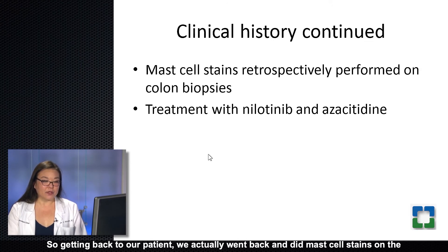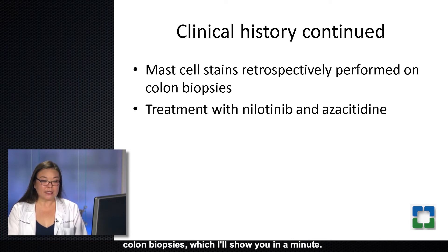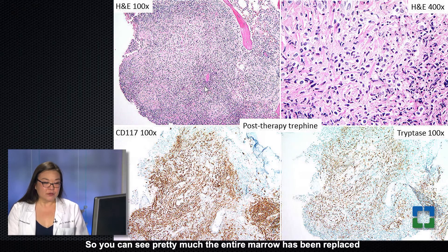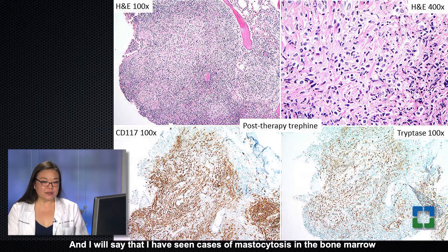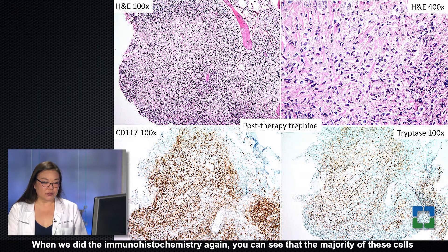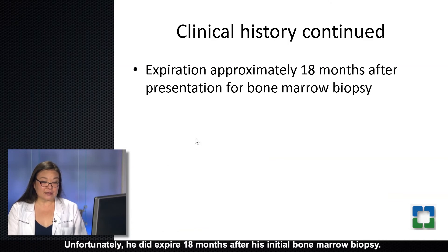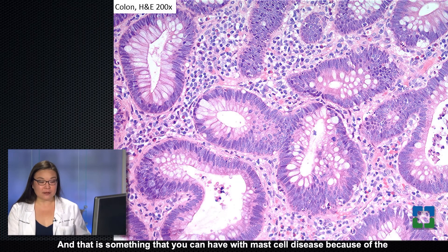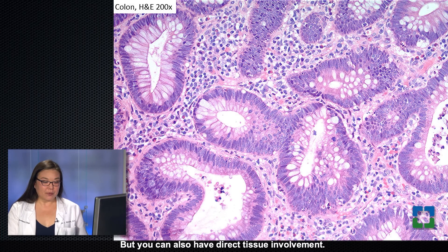Getting back to our patient, we went back and did mast cell stains on the colon biopsies. He was treated with nilotinib — targeting his mast cell disease — and azacitidine for his CMML. Unfortunately, this was his bone marrow trephine after that treatment, and you can see that pretty much the entire marrow has been replaced by a now much more spindle-looking infiltrate. I have seen cases of mastocytosis in the bone marrow misdiagnosed as granulomas, so that's always something to keep in mind when you see spindle-type lesions. When we did the immunohistochemistry, you can confirm the majority of these cells are mast cells. Unfortunately, he did expire 18 months after his initial bone marrow biopsy.